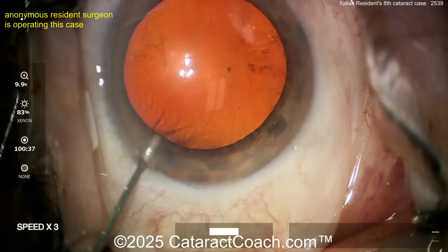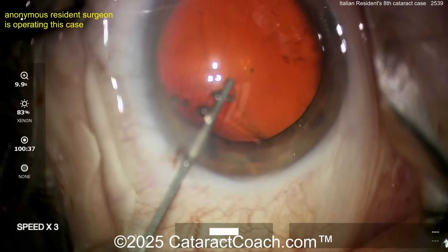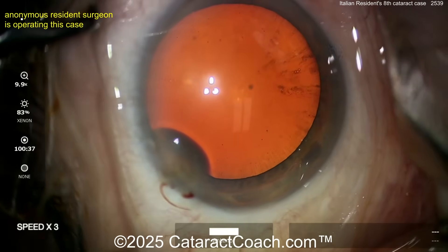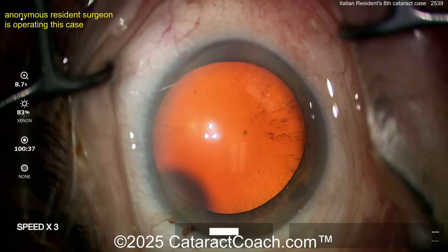Starting off, we have an anonymous resident. We sped the video up to three times the normal speed. This is impressive for case number eight. It's totally anonymous, as we do with all resident videos. You have to believe the resident — and remember, the new generation learns faster than we do because they have the benefit of these videos.